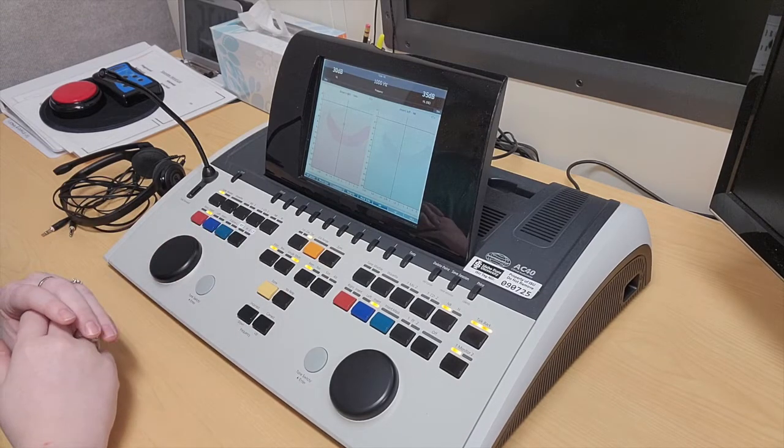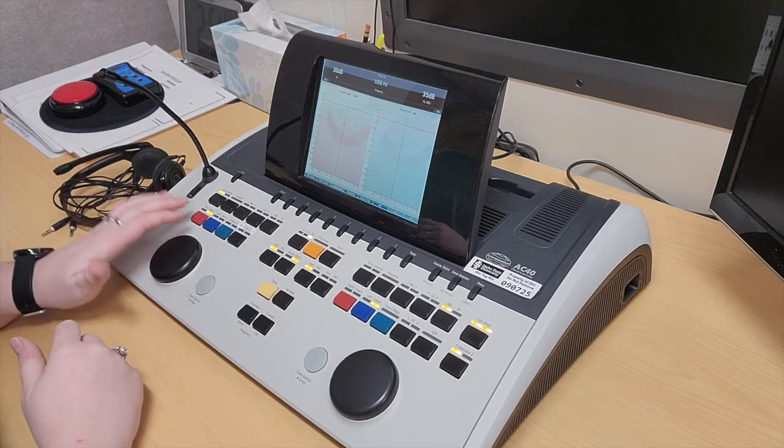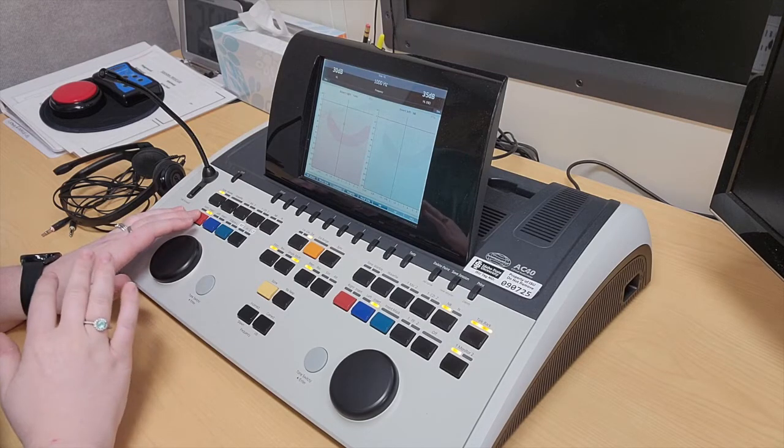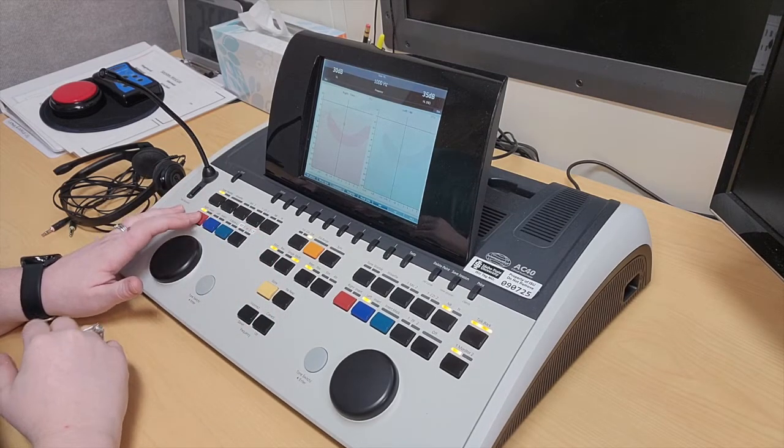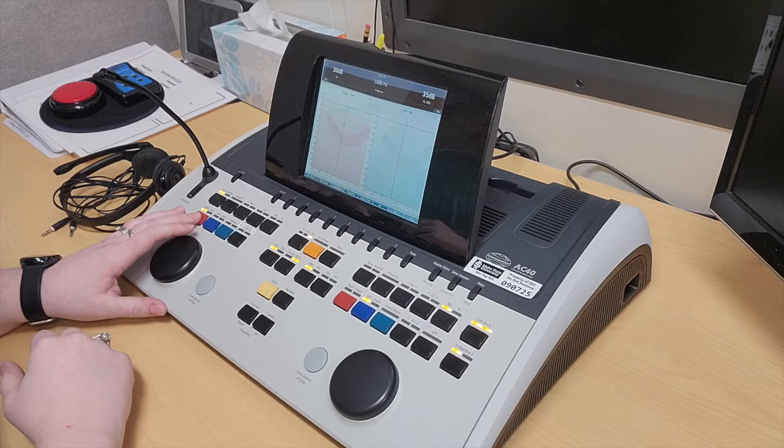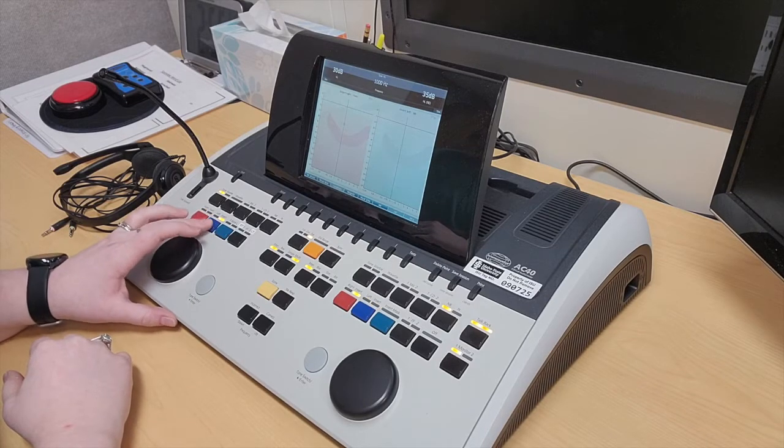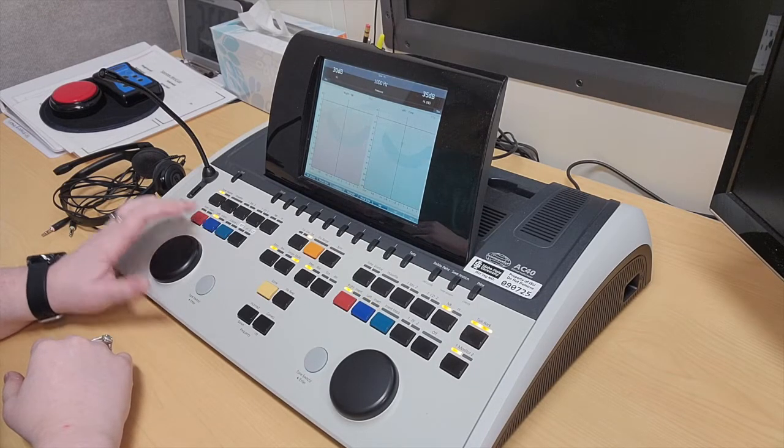In terms of selecting transducers, this button toggles between insert and supra-aural headphones. Pressing that, and then the same here for the left one.